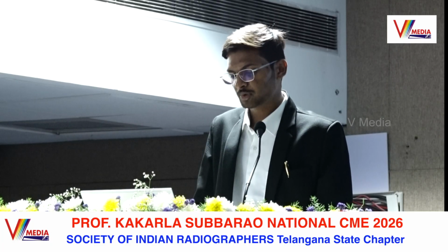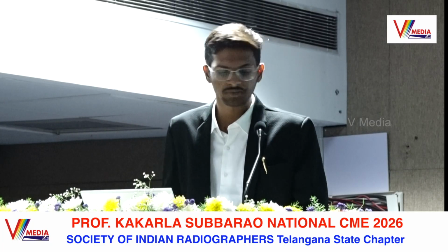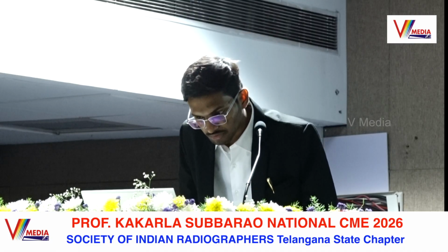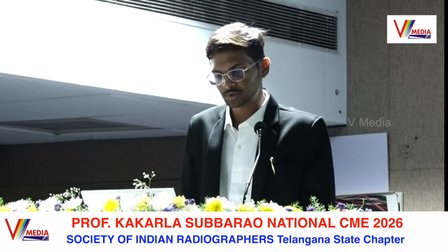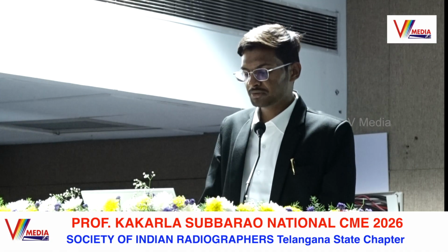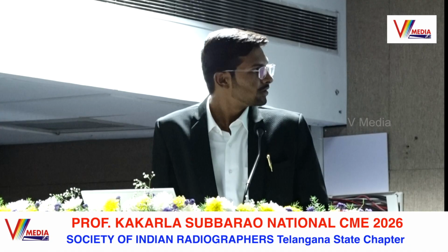in the imaging modality. CT angiography plays an important role in the evaluation of peripheral artery disease and conditions like occlusion, blockages, stenosis, and some other diseases. In CT angiography, we see the arteries clearly in reconstruction modalities like multiplanar reconstruction and 3D volume rendering. And the anatomy we will be seeing here.